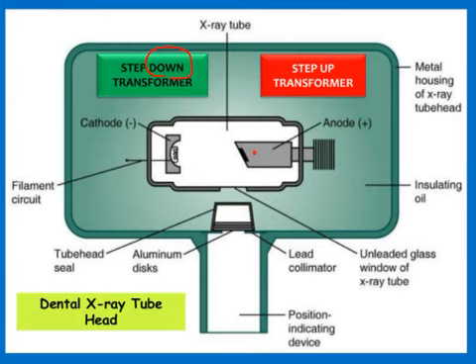So we use a stem made of copper, which is a good conductor of electricity and a good conductor of heat. Here we use a copper stem, which is the gray colored area. This is used to help remove the heat from within the dental X-ray tube to outside the tube. If the heat stays within the tube, it can result in melting of the tube.